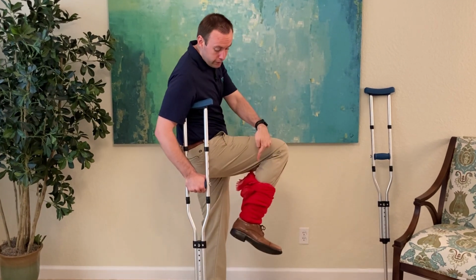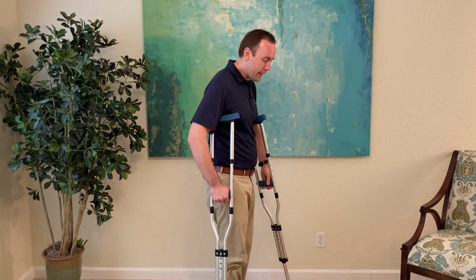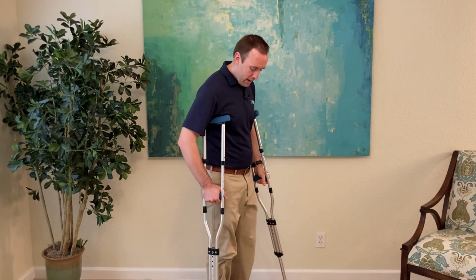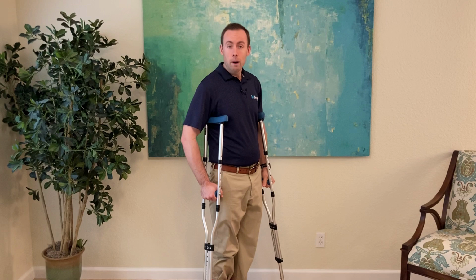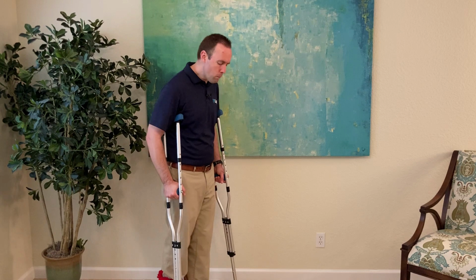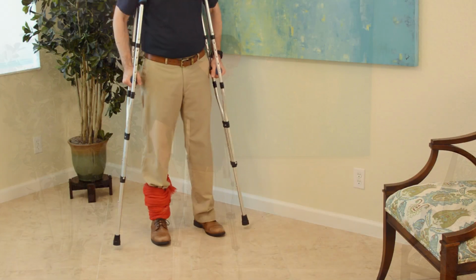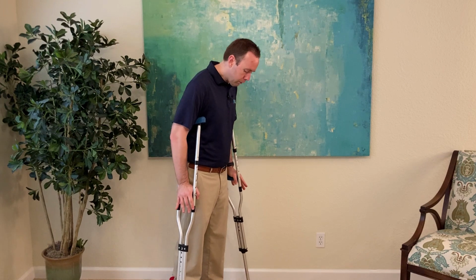I've got my injury down here, and we're going to pretend that my right foot, the hurt one, is hurt, and I'm going to show you how to walk with these crutches. There's a couple different ways to do this. So assuming that we can put some weight through my hurt foot, you're going to stand with your feet shoulder width apart, and your crutches are basically in line with your feet.